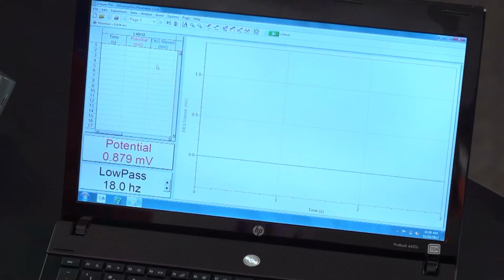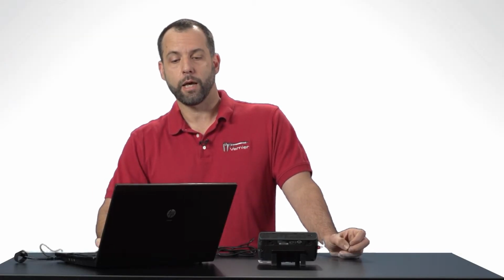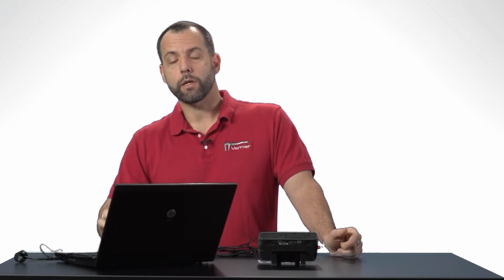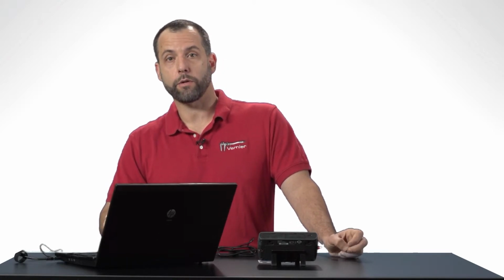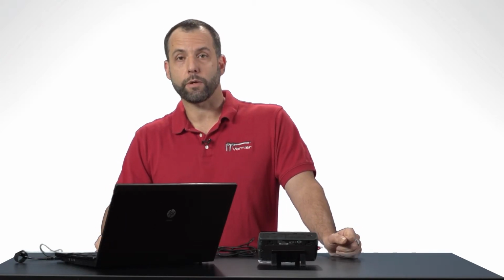Now in this file, it's going to record for three seconds. I have a little what we call parameter control down below, which I can use to set the low pass filter. And then this right here is the EKG that is filtered. So what you will see is the EKG trace after a filter has been applied to it. An important thing to do as well though, is I'm going to zero the EKG sensor before I record and I'm going to increase the sampling rate.